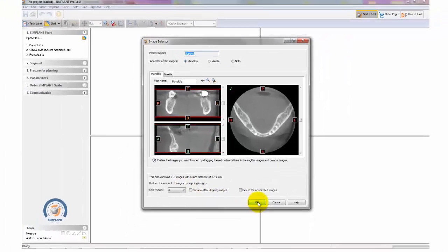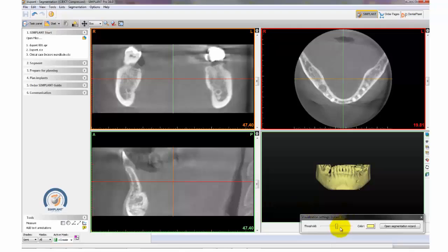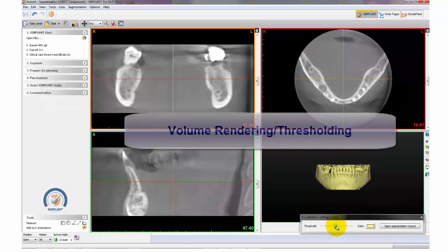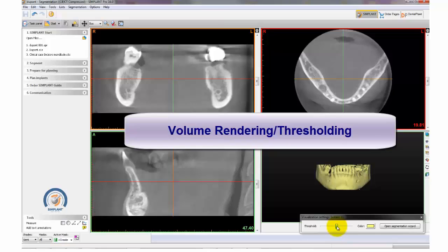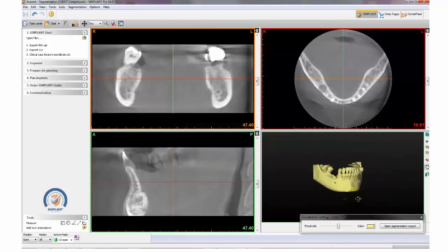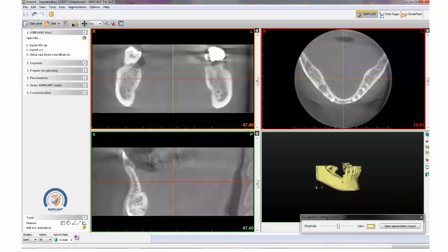Once your case is open in Simplant, you have the option of reducing the amount of bone shown by using the volume rendering tool. You can do so by sliding the bar left to right until the bone is reduced to your desire.